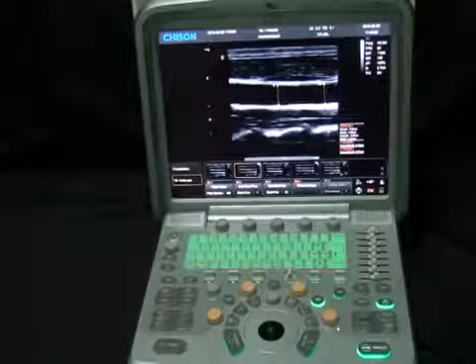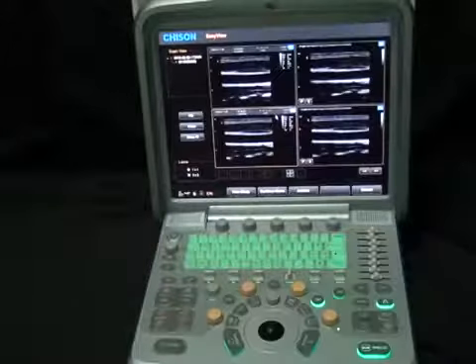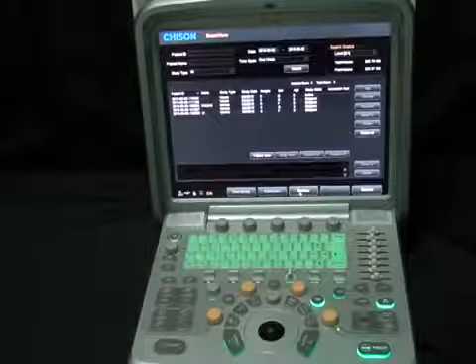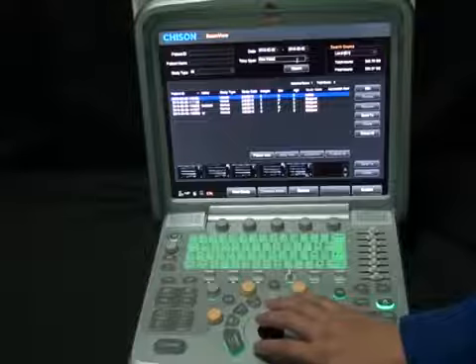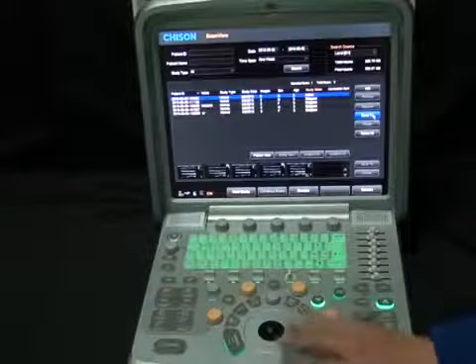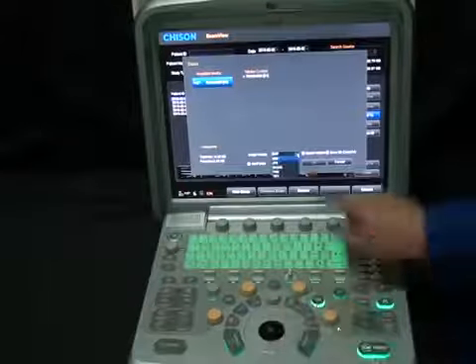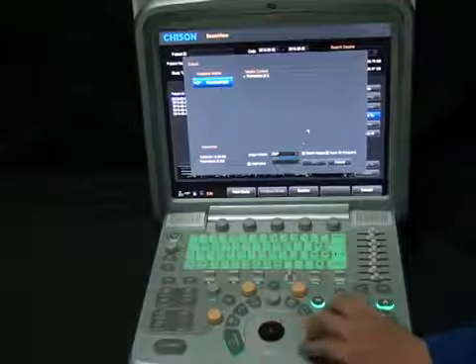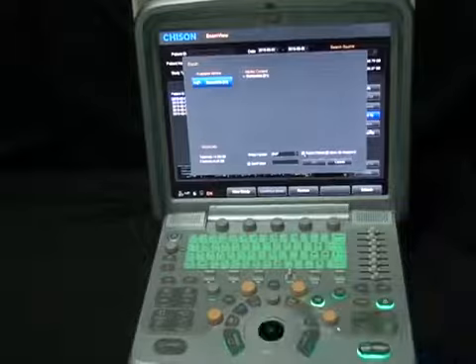First, insert the USB disk. Press the Archive key and select Archive. Then you can choose Send or Backup the images. We can choose different formats for the transfer: BMP, JPG, DICOM, PNG, or TIFF. The cine will be transferred to AVI format directly, so you can read it on a PC directly.